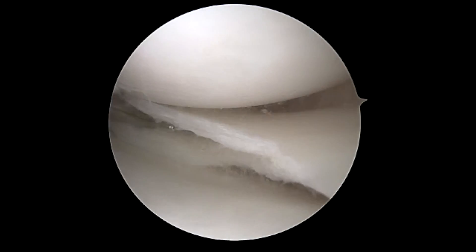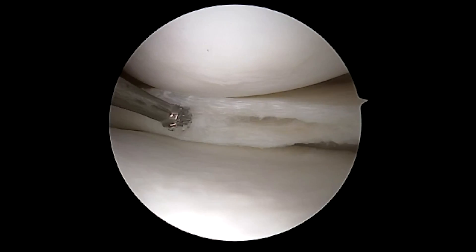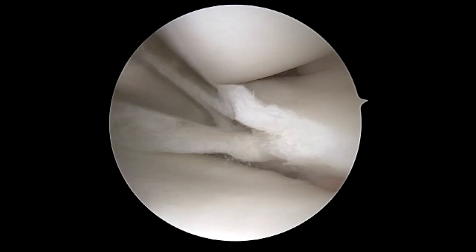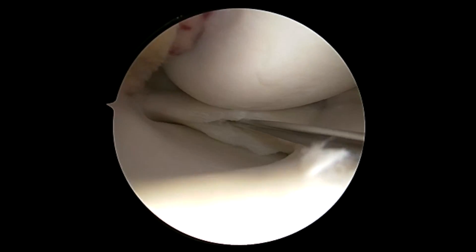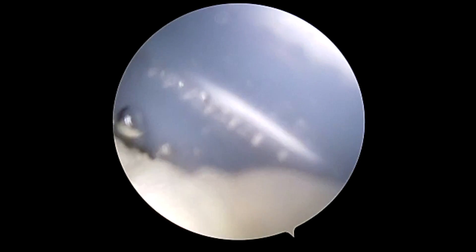Here we are again preparing with the ball rasp the meniscus tear all the way back to the capsule. This will allow for better healing potential. Following this, we will do trephination into the capsule to allow for maximum bleeding potential and stem cell egress.